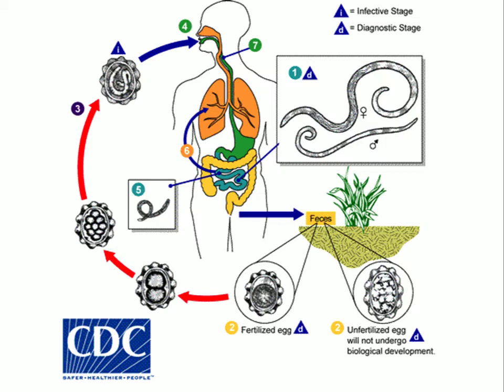If an unfertilized egg is passed into the environment, it will not undergo development and it will not become infective. It can be diagnostic, right? You can see an unfertilized egg in the stool, but it's not going to be something that can actually cause infection because it doesn't develop into an organism. The fertilized eggs definitely are infective.